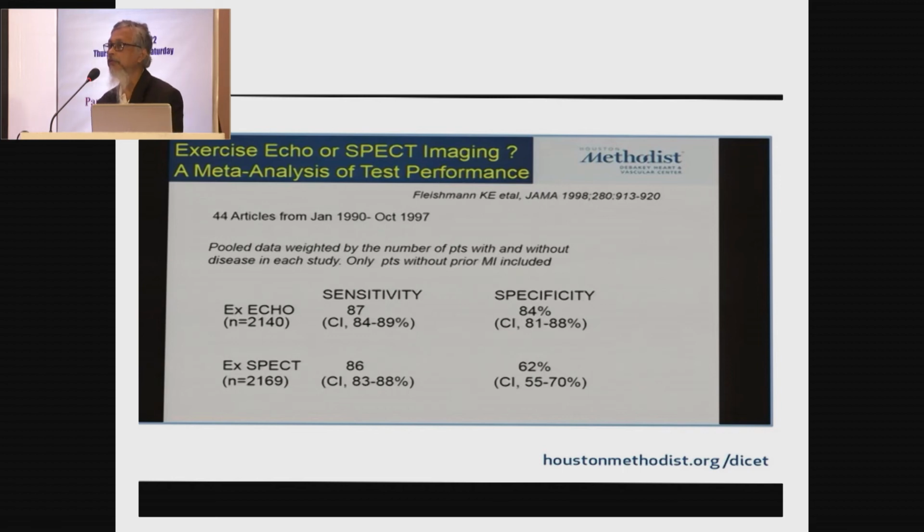So the test that we are doing in our laboratory, the bicycle ergometer, is superior to SPECT, and we are used to it with echocardiography. So it is our skill in echocardiography that prompted us not to refer our patient for SPECT. Had this patient gone for PET, that could be a little superior. Or if the patient had a CT angiogram along with FFR, that would have been better. But right at this moment, we are satisfied with doing the bicycle stress echo, which yields at least 80 to 85% sensitivity, much closer to that of MRI or PET.